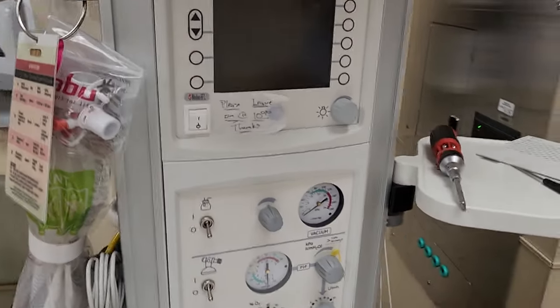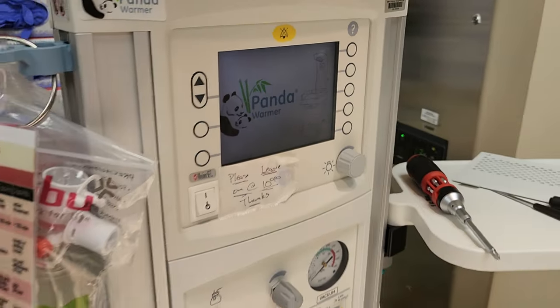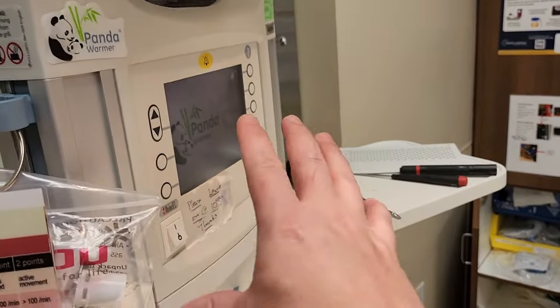So this is the front of the panda warmer. Right here is the power switch, and when you flick it on, before I had no display — it was just regular dark. But even without a display, I knew that there was DC power.